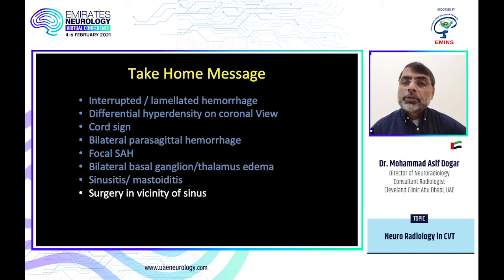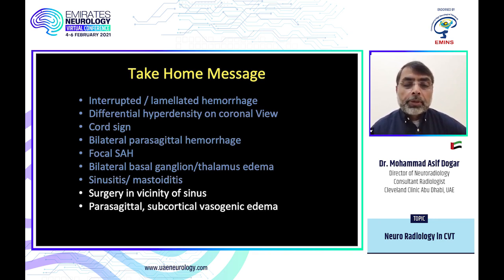If there's a surgery in the vicinity of the sinus, make sure you look carefully on the 3D or the coronal reconstructed image to make sure there is no differential density. And again, if the patient has parasagittal, unilateral or bilateral, subcortical vasogenic edema, look at the patency of the superior sagittal sinus.